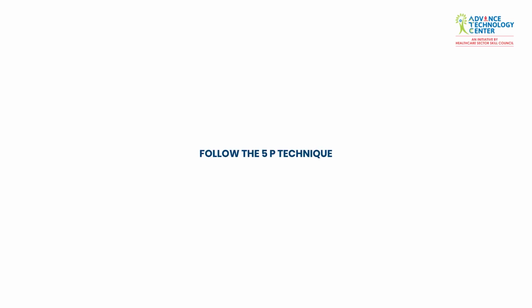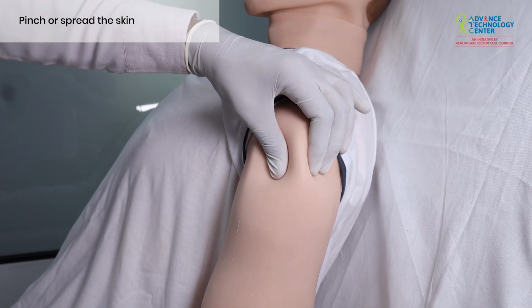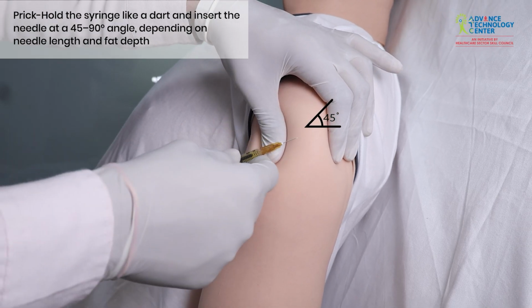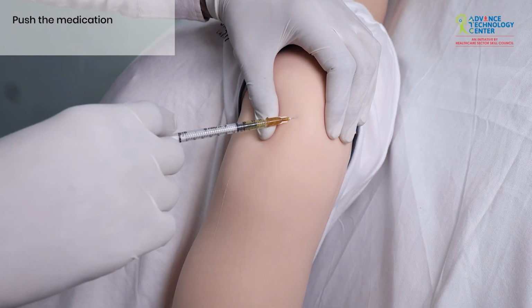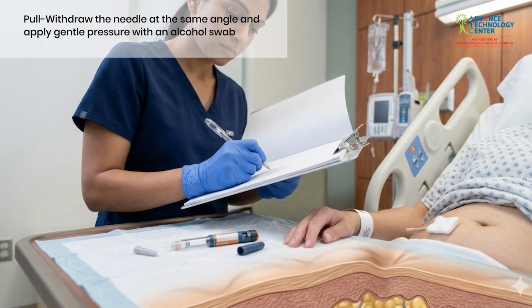Follow the 5P technique. Either pinch or stretch the skin depending on the patient's body type. Prick: hold the syringe like a dart and insert the needle at a 45 or 90 degree angle, depending on needle length and fat depth. Push the medication. Pause for 10 seconds. Withdraw the needle at the same angle and apply gentle pressure with an alcohol swab.